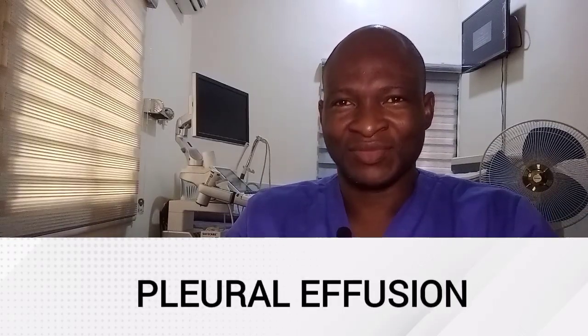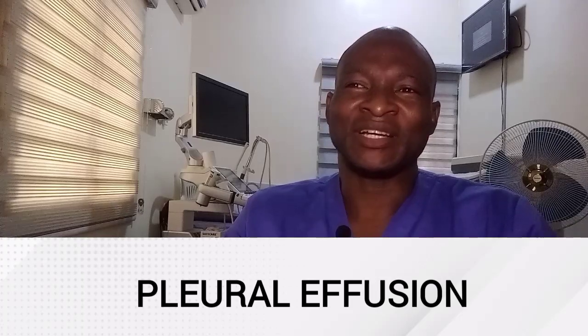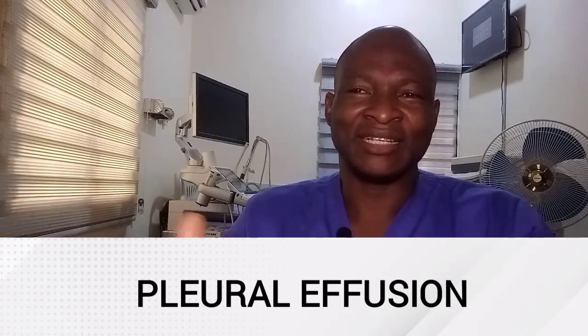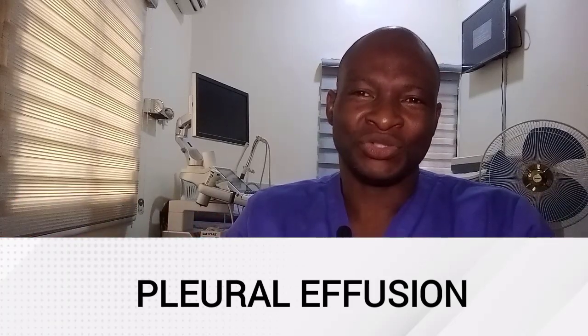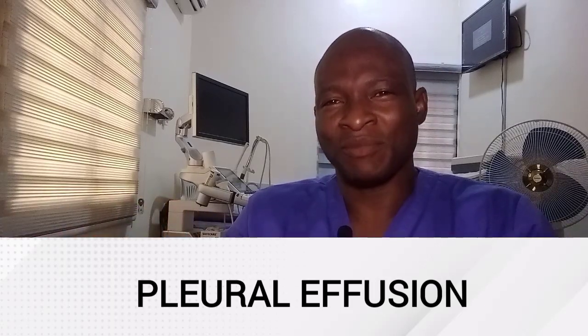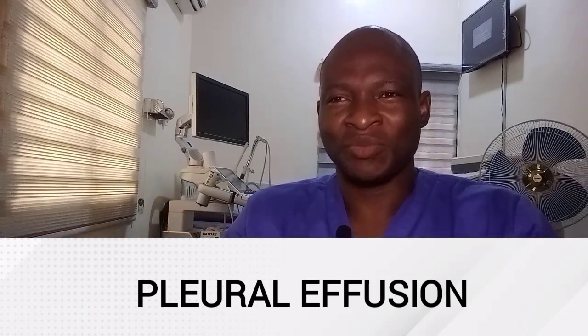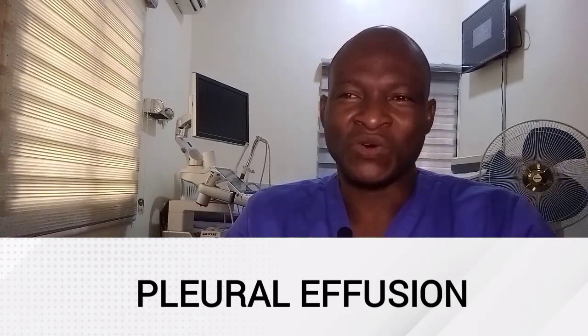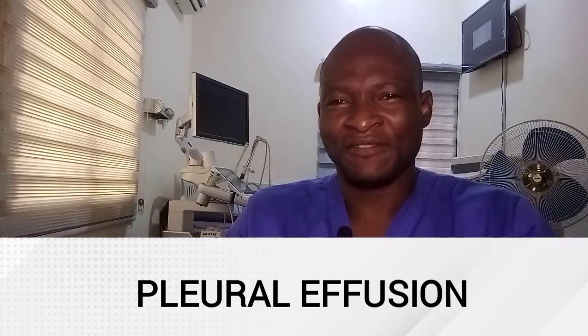Let's look at pleural effusion. Now, the fluid collection around the lung is referred to as pleural effusion, and readily can be identified during a sonographic examination of the abdomen. During abdominal sonogram, the lower chest should be evaluated for signs of pleural effusion.